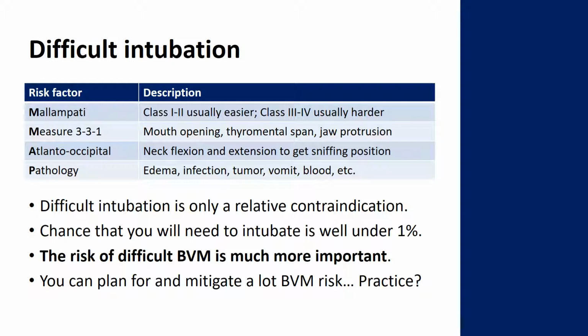And with bagging, you can plan for and mitigate a lot of the problems that come along with that. So you can talk to the nurses about the two-person technique, or you can make sure that you've sized an oral airway or sized masks. And you can almost get like a practice round too, right? Like you could take a mask and put it on their face and see if it fits. You could try putting gel on and see if that actually works even before you go into the sedation.